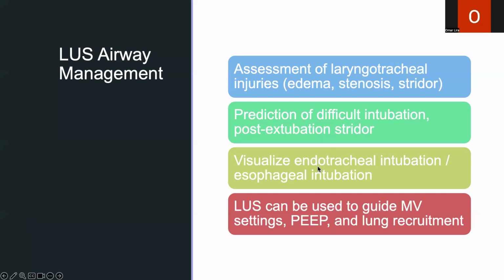Lung ultrasound can be used to guide mechanical ventilation settings, PEEP, and lung recruitment maneuvers. Lung ultrasound can be a key tool in early diagnosis of the most common complications of mechanical ventilation.